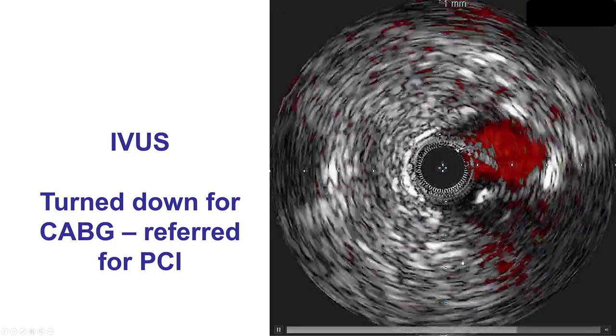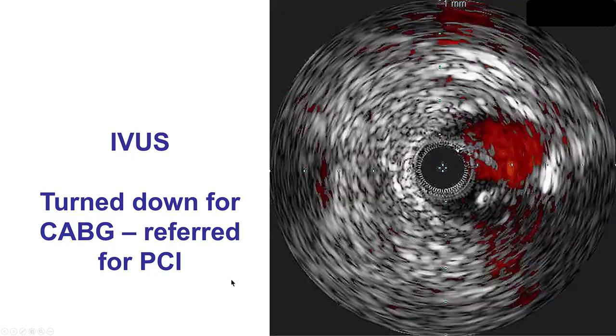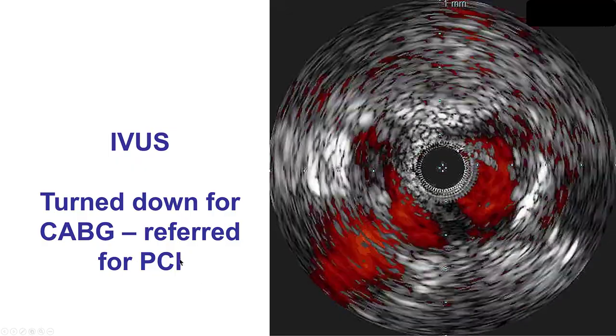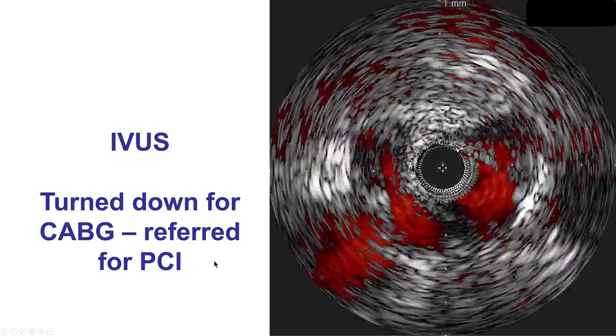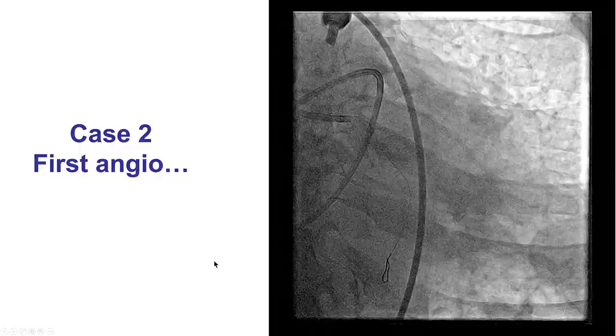An IVUS was performed in the left main and it demonstrated significant stenosis along with areas of calcification. The patient was referred for coronary bypass graft surgery, but he was turned down and was referred for PCI instead.